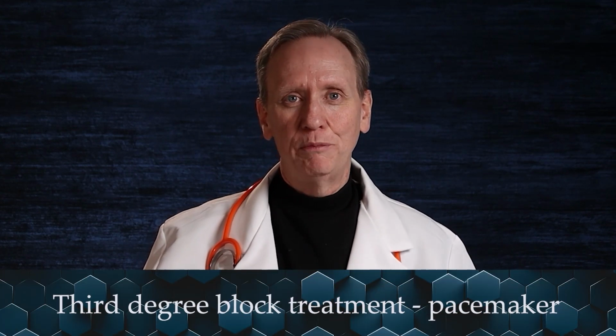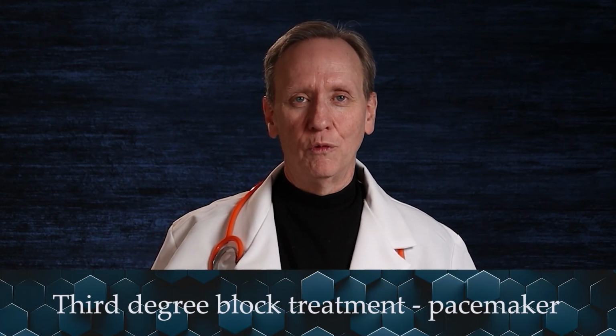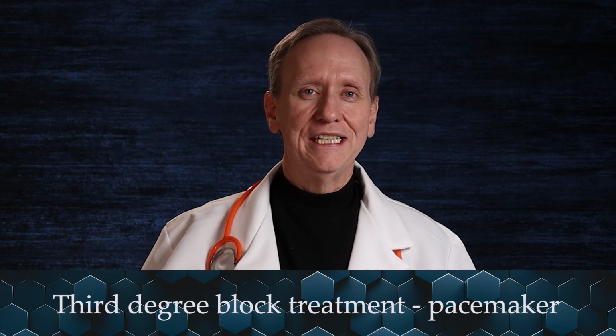Now, the treatment for a third-degree block is external cardiac pacing, or a pacemaker. And this is where we put patches on the patient with wires attached to a machine. It detects some signals there, and it just gives the heartbeat to them. It originates the original beating pulse or the electrical signal so the heart can receive that signal. So that's the treatment for a third-degree block.